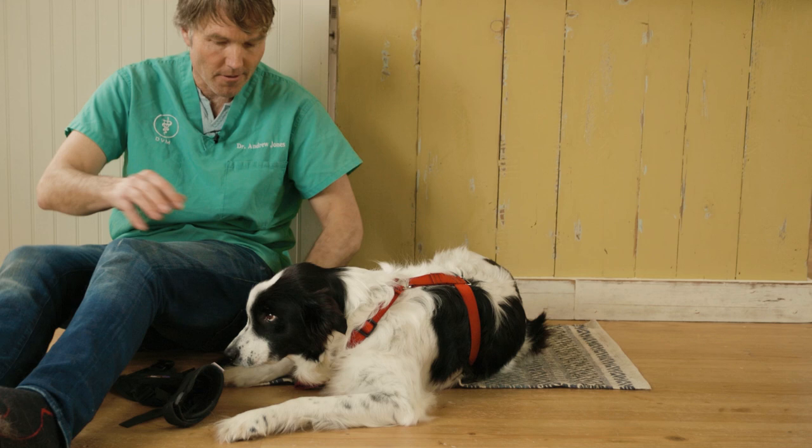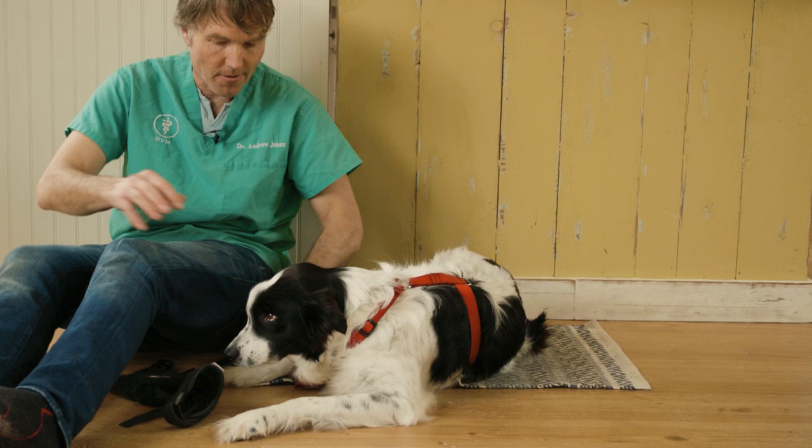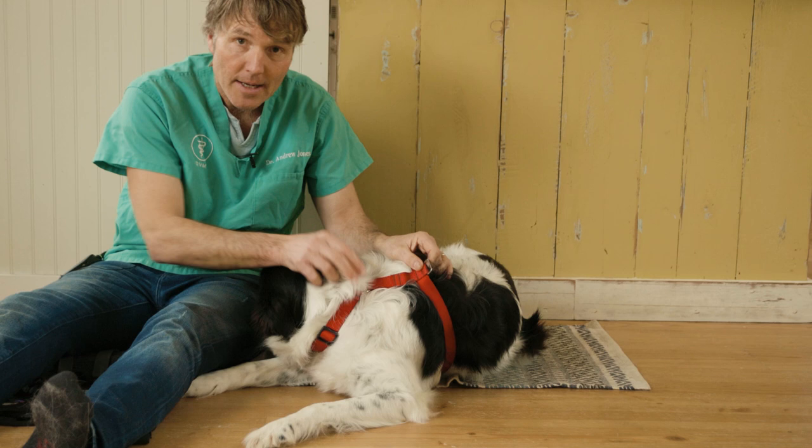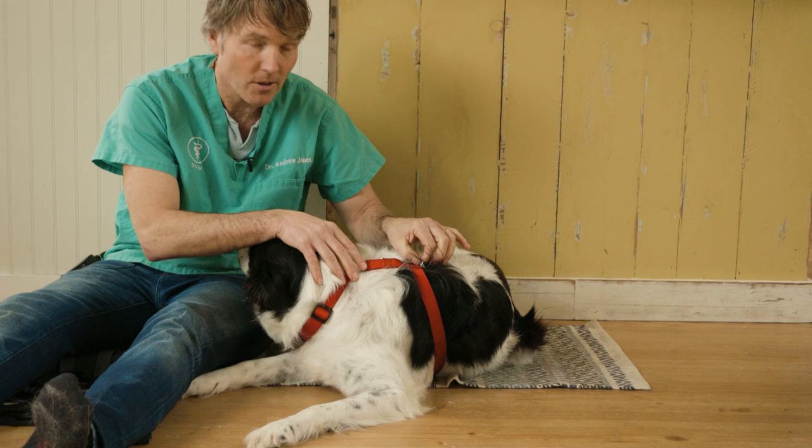The brace consists of four parts. The first part is this chest harness — one strap going up around Heather's neck, and a second strap going up behind her arm, going around her chest. You've got this metal anchor which the actual ACL brace hooks itself onto.